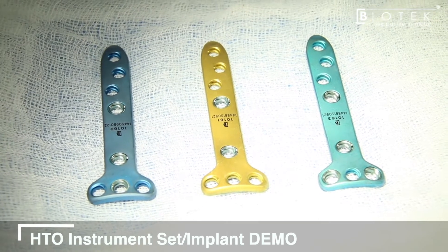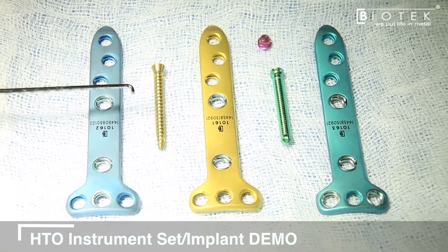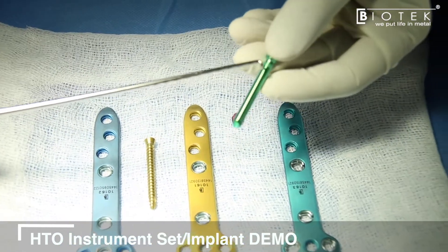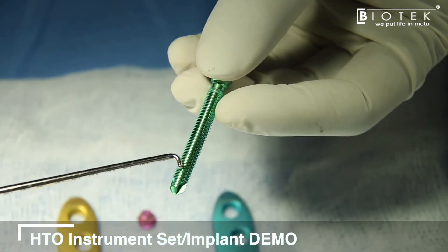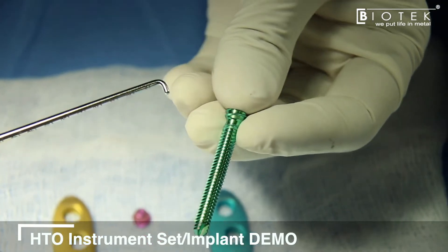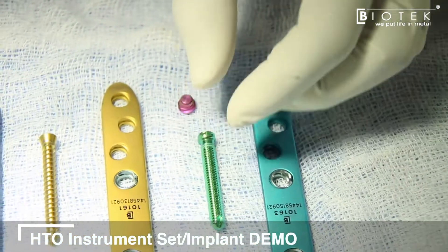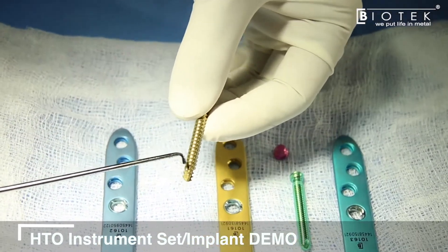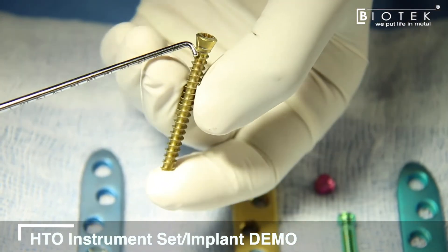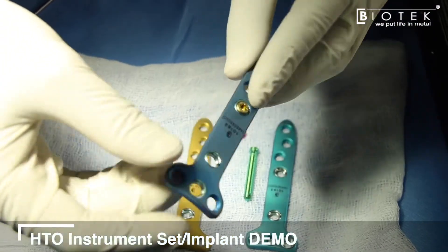Along with this plate system, two kinds of screws are provided in sterile packs. The locking screw has good pitch distance for strong bone purchase, is self-tapping — no tapping required — and has threads in the head for good locking with the plate. The non-locking screw is also self-tapping and has a modified head designed to sit completely flush within the plate with nothing sitting proud on top.